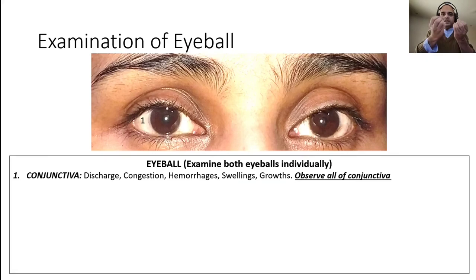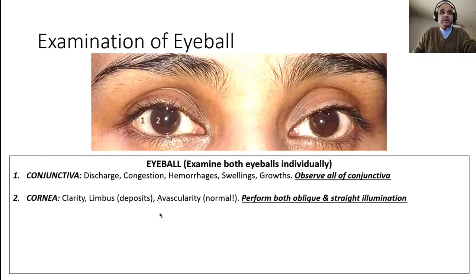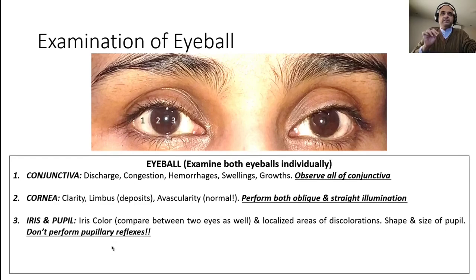Ask appropriate permission from the patient, ensure nails are clipped and hands are warm. Then examine the cornea — assess its clarity and the limbal area for any deposits. The limbus is the junction between the cornea and sclera. The cornea is avascular, so if you see any gross aberrant vessels growing on it, mention them. It is examined with oblique and straight illumination as described in your clerkship manual. Then move to the iris and pupil — do not perform pupillary reflexes.